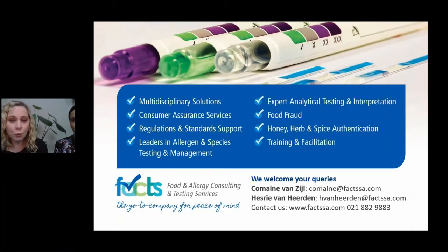So that is why, for example, it's important to know in the case of milk which milk portion your product contains and which milk portion the rapid kit detects. So no, it's not needed to test for whey and for milk protein. You just need to know which milk protein is in your product, and you need to know which milk protein the rapid kit, or any method for that matter, detects. Because if you use majority whey protein and you use a method that detects casein, you are going to get a false negative. So it often goes hand in hand in understanding actually what people react to, and understanding that different people react to different proteins in products, and different people have different tolerances to, for example, the same protein.